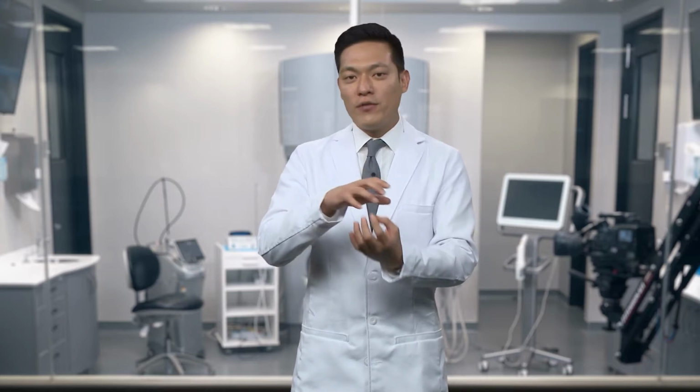If the bite is off in any way, if the patient's bite is slightly open, that would lead to a very high restoration. And certainly we want to avoid that because there would be a lot of adjusting when the restoration's back and tried in on our patient. So let's review some steps and tips on how to ensure that we can scan the patient's bite accurately for that precise fitting occlusion. Let's take a look.